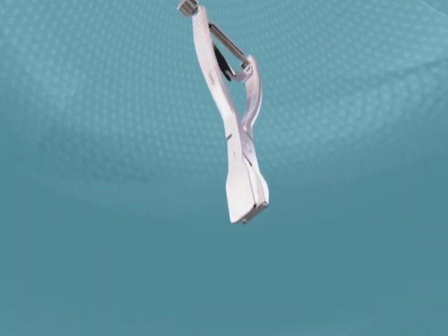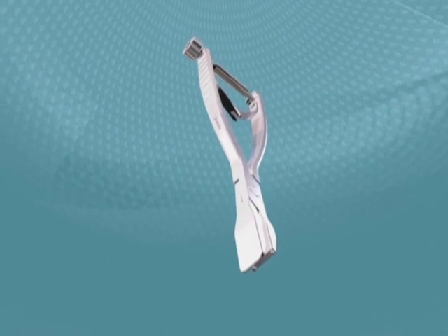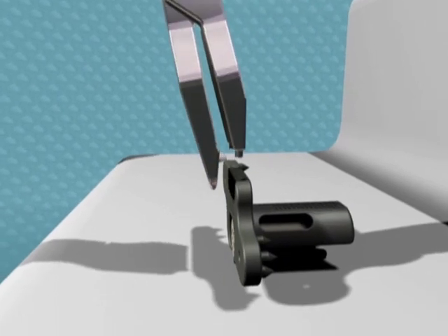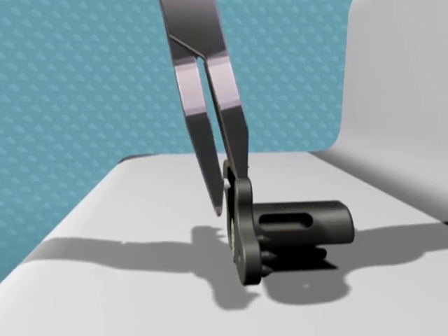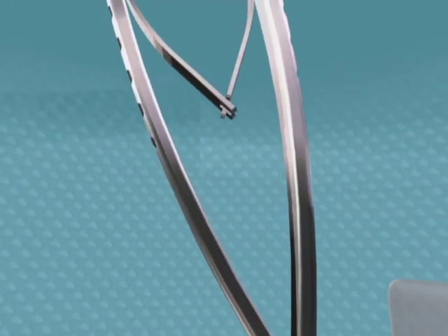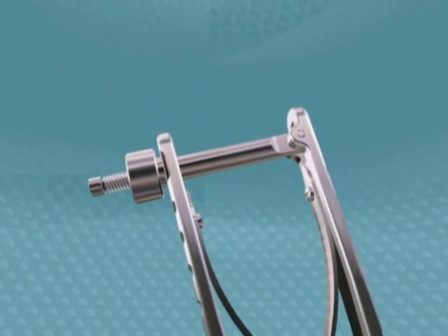Attach the plate post body of the implant to the plate post body inserter. The small pins on the inserter tip engage the slots along the top aspect of the post plate. The adjuster knob must be tightened fully to secure the implant to the inserter.